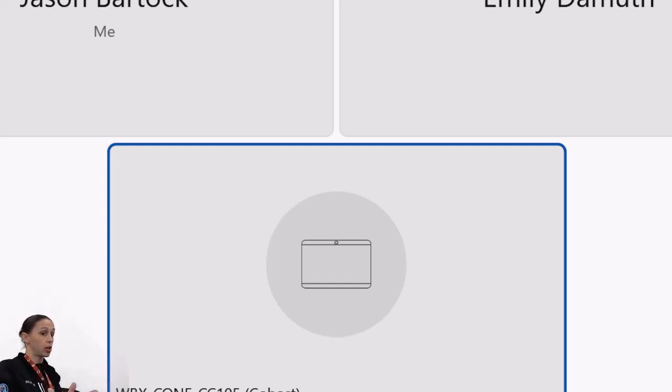So as you're reducing your arterial flow and the patient's hemodynamically tolerating it, you can do echo assessments while you're doing that. You start to see, well, hey, we're lowering that arterial support, that right heart support, and he's tolerating. But you can't totally just clamp off an arterial cannula because you'll thrombose or cause a stroke, so it's a little bit of a leap of faith even when you do those ramp trials with an echo. I don't know with certainty that you could successfully come off.